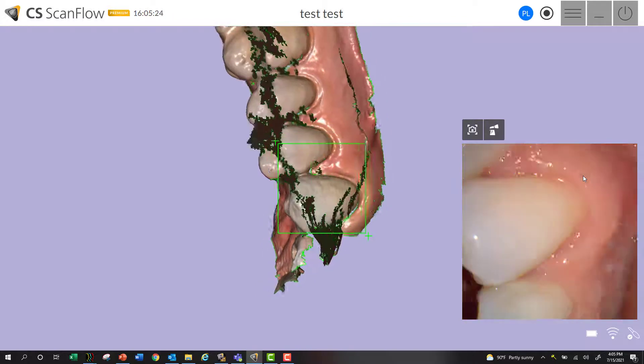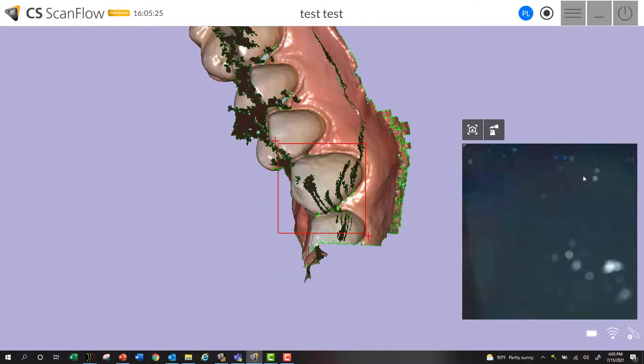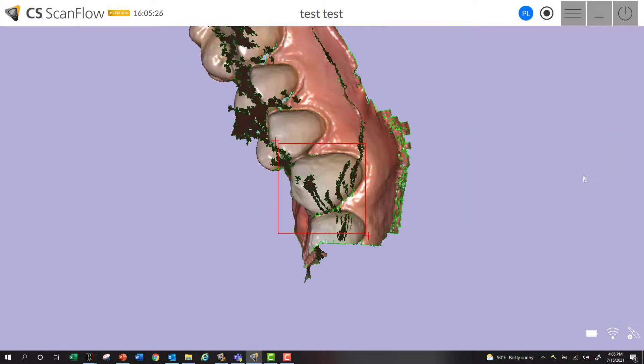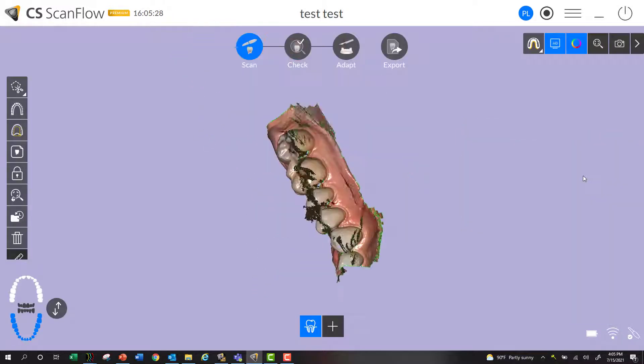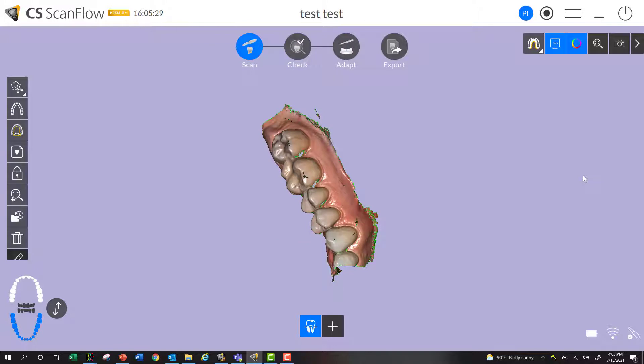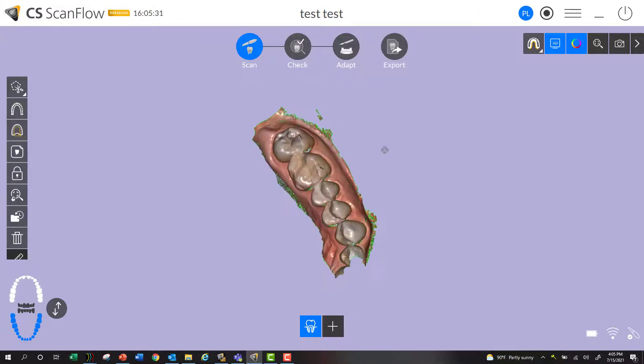And when I remove the scanner from the patient's mouth and give it a couple of seconds to process, you'll see it will automatically remove the soft tissue, which is nice, just so you can visualize everything nice and clear.